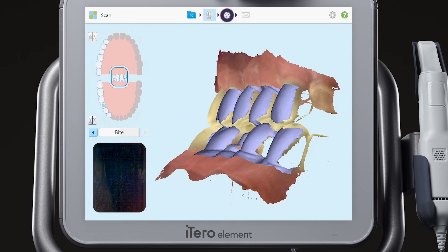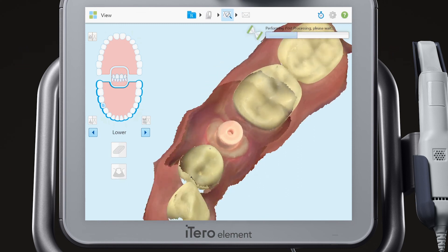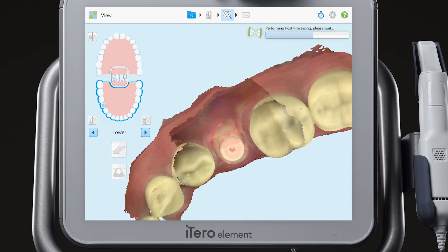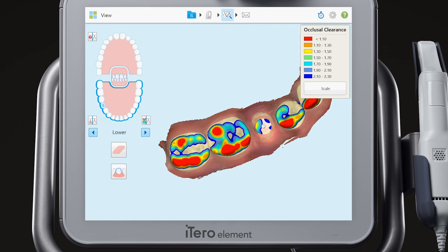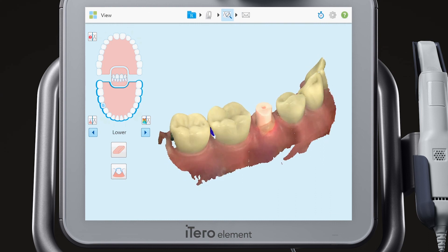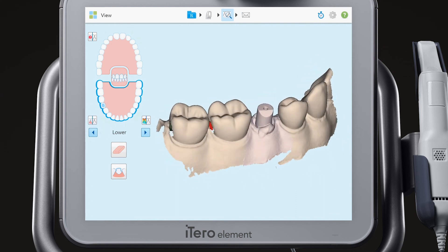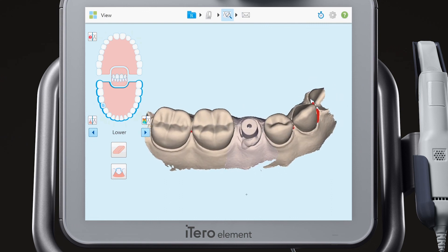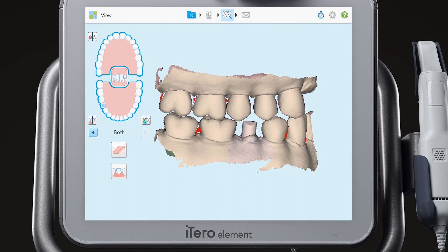Tap the view icon. Review the segment to ensure full capture of anatomy and contacts. Turn the color off to see the model with more detail. Tap on the opposing arch to review the bite relationship. When you are finished, tap the envelope icon to send the case.